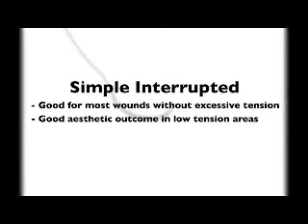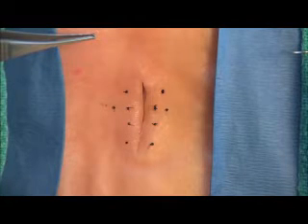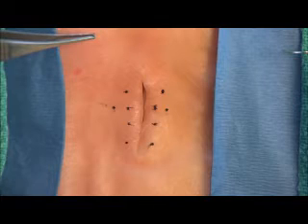Before we get sewing, let's review the indications for a simple interrupted suture. The simple interrupted suture provides a good aesthetic outcome for most uncomplicated wounds, provided that the wound is not under excessive tension. We have marked out our entry and exit points for our three types of sutures, to aid the learner in visualizing proper suture placement.